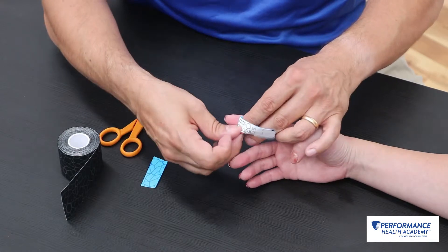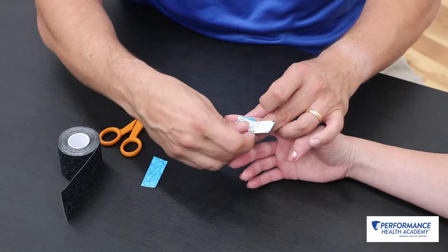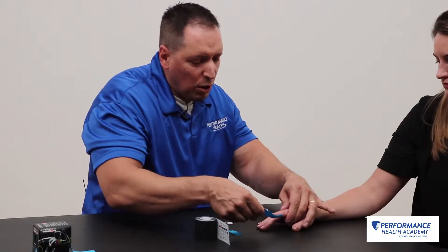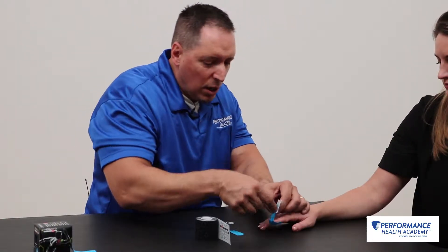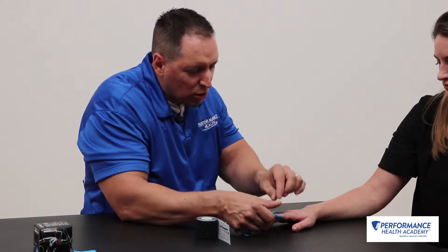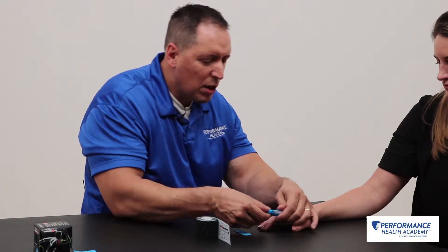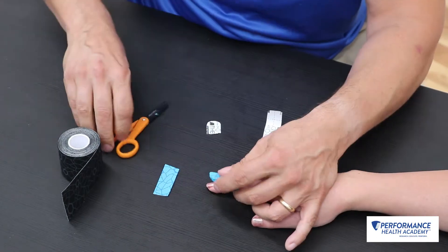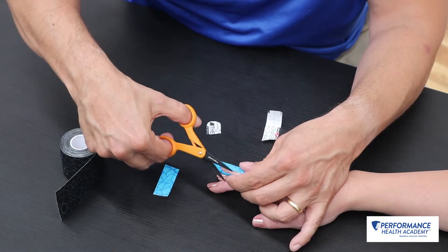We're going to bring that at anywhere from 25 to 50 percent tension on this tape, bringing it over the pulp into a little bit of hyperextension with no tension on the tail, just at the PIP, and end there. Sometimes you'll get these little dog ears — you can squeeze and trim those back.